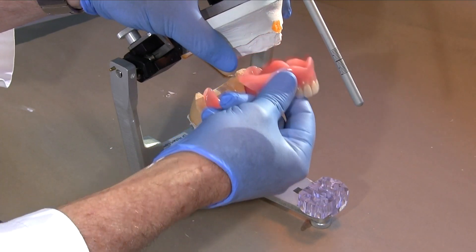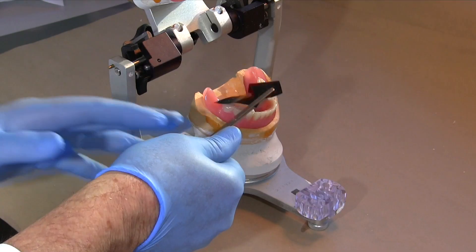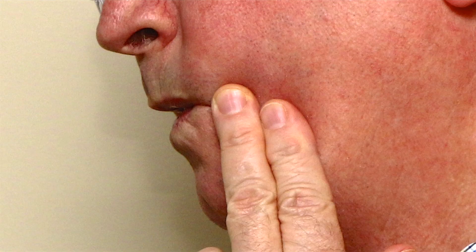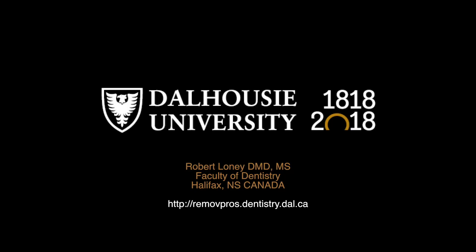Use of the clinical remount will often help clinicians find difficult to diagnose denture problems and reduce recurrent adjustment appointments. Use it routinely for denture deliveries and for denture troubleshooting appointments, and you will find that it expedites resolution of problems and improves patient satisfaction. This is one of several videos on denture adjustment — look for the others on my website or my YouTube channel.